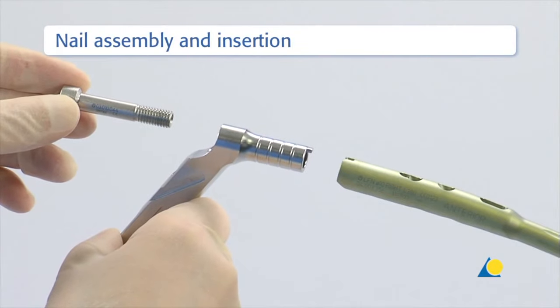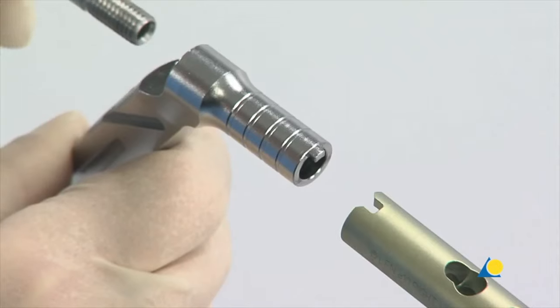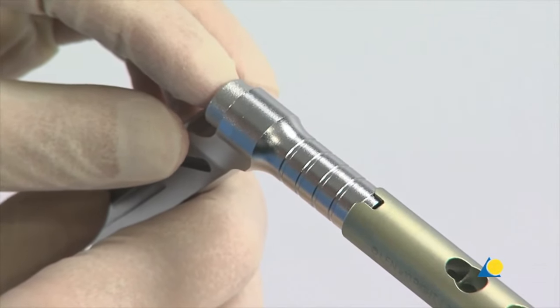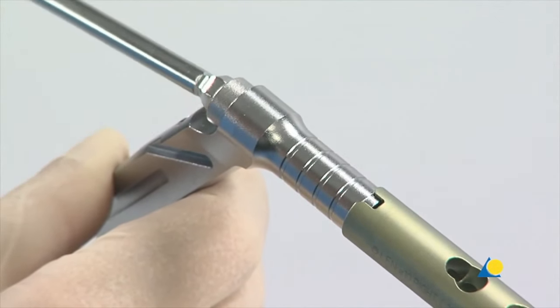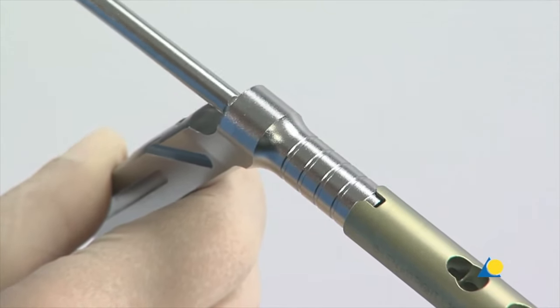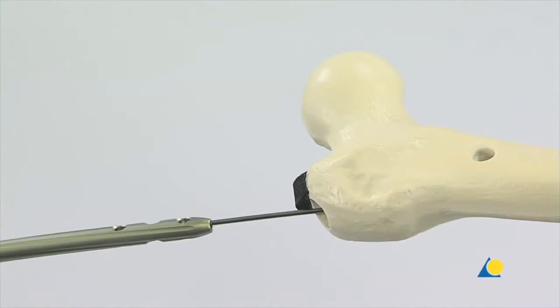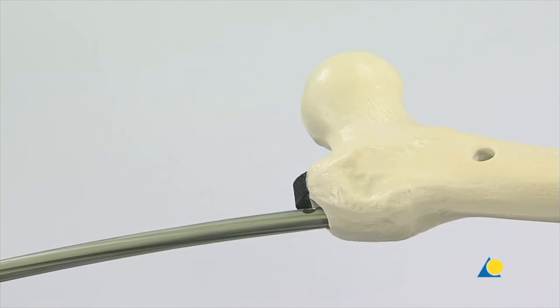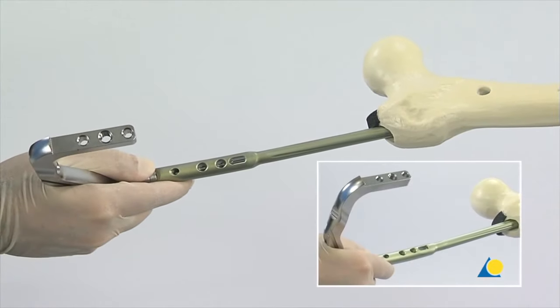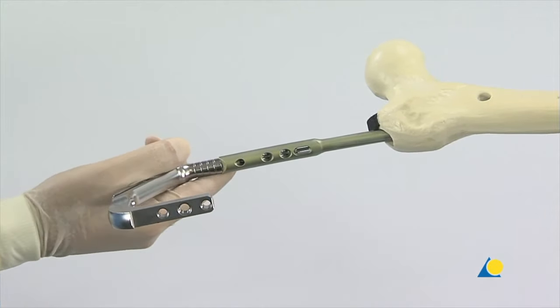The appropriate nail, insertion handle and connecting screw are selected. The insertion handle is oriented lateral to the nail, the connecting screw is slid through the insertion handle and the tongue of the handle is slid into the groove of the nail. The connecting screw is threaded into the nail using the screwdriver with spherical head. The screw is fully inserted but should not be over-tightened. The nail is slid over the reaming rod and inserted into the medullary canal with the insertion handle. It is important that the insertion handle is oriented anteriorly. As the nail is inserted, it rotates approximately 90 degrees from anterior to lateral to align anatomically with the femoral canal.